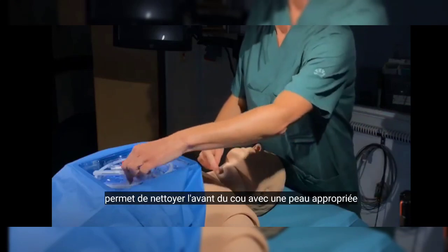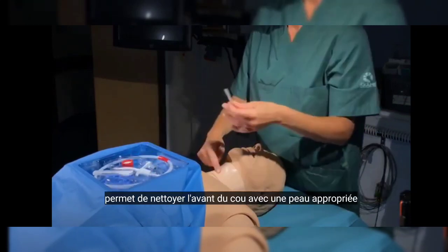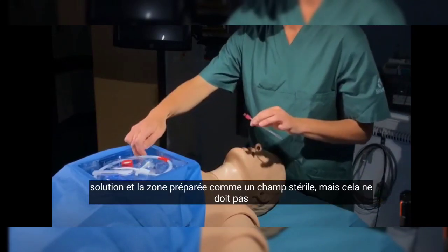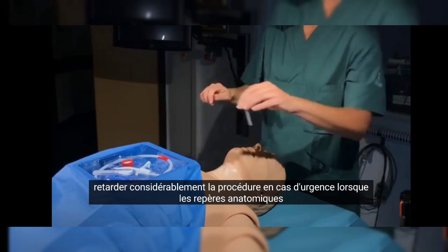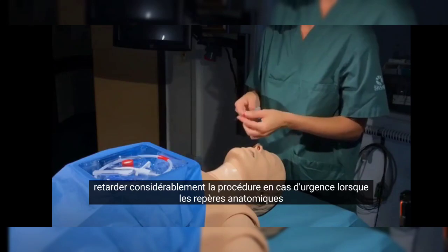If time allows, the front of the neck should be cleaned with an appropriate skin solution and the area prepared as a sterile field, but this should not significantly delay the procedure in an emergency.